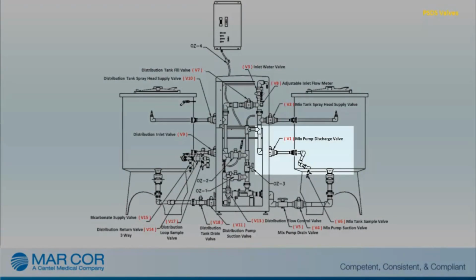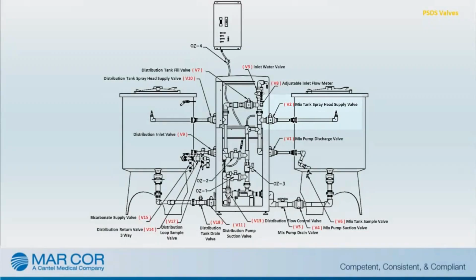When opened, V1, the mix pump discharge valve, allows flow from the mix pump into the mix tank. When opened, V2, the mix tank spray head supply valve, allows flow from the mix pump to the mix tank spray head. The spray head delivers spray to cover internal portions of the mix tank.